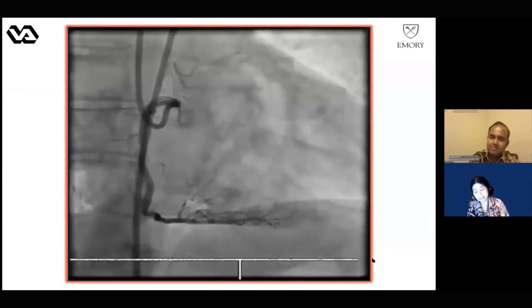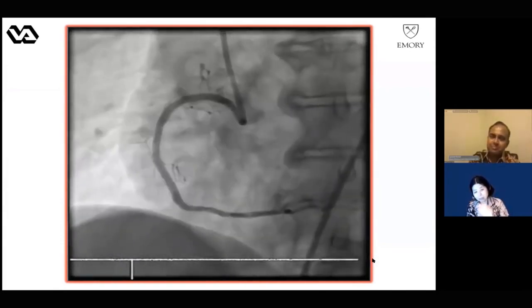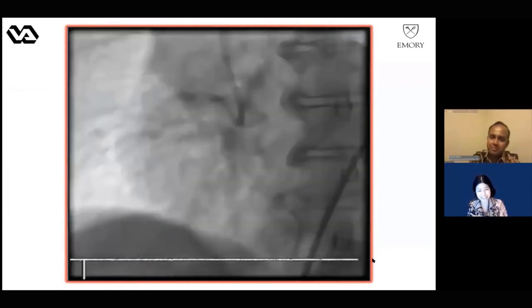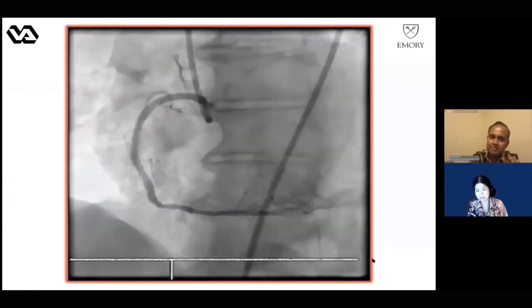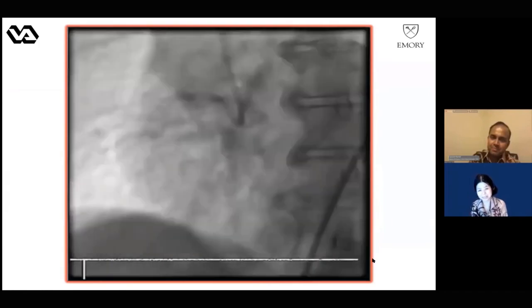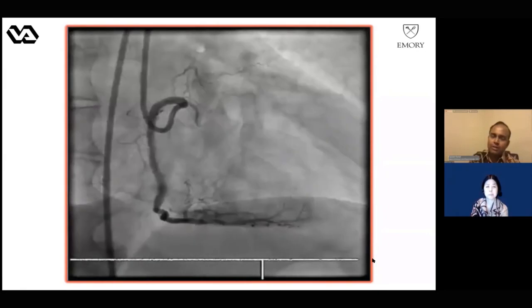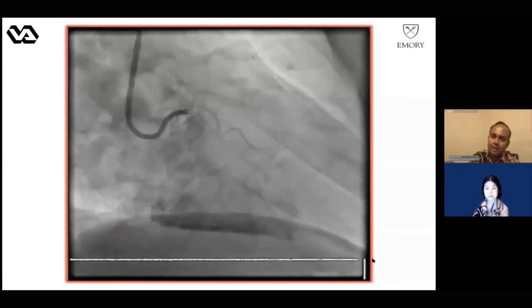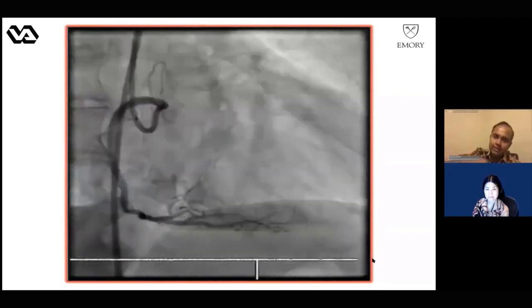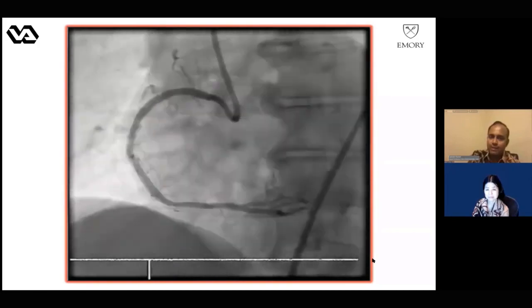Actually, the entry side is already behind the stent. Yes. So because of the pushing into the lumen, you have to put the stent. But there is one slice where I still see hematoma, which may not be covered by the stent, but that should be okay, because you covered the entry site already, and the lumen is big enough. Yes, and we actually thought that we covered the entire thing up to the aorta, because you can see we were able to disengage and re-engage with this Amplatz guide with no difficulty after the flash.